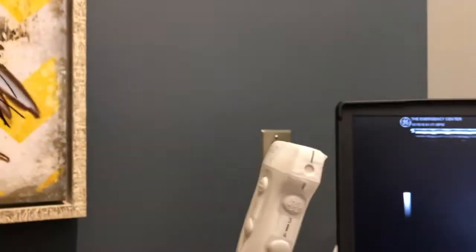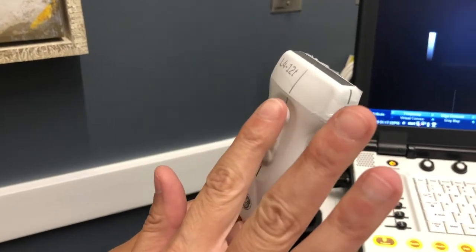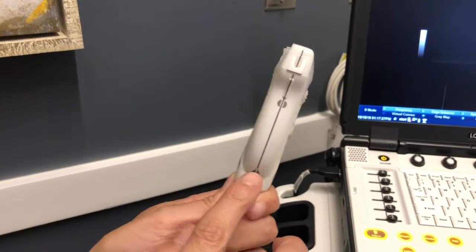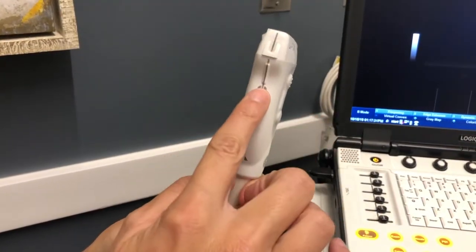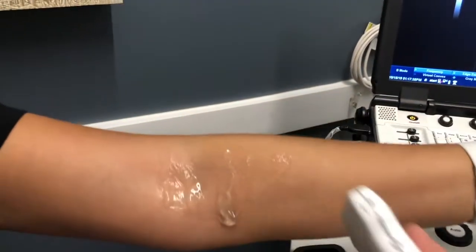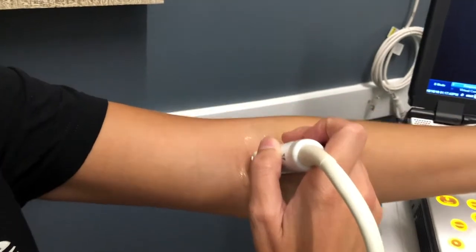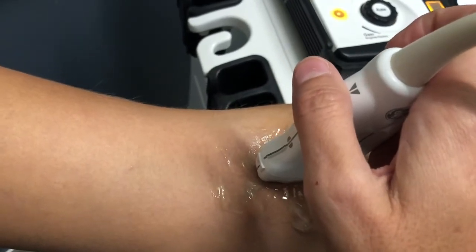So here's your probe, and these probes have little buttons on them that you won't have to worry about. When you hold the probe, this side, no buttons, is going to be the top of the probe. When you put it on the arm, this side is going to go up towards the head. So you can see the top of the probe is towards the top of my arm.